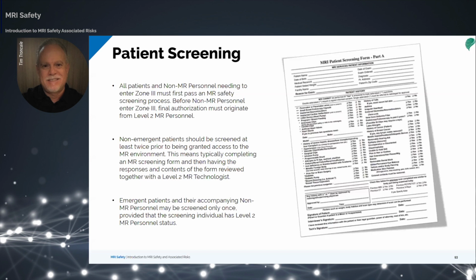Anyone entering Zone 3 must be screened before being permitted in, as I mentioned. This includes, but is not limited to, patients, anyone accompanying the patient, healthcare workers, physicians, service and maintenance personnel, just to go over those again.